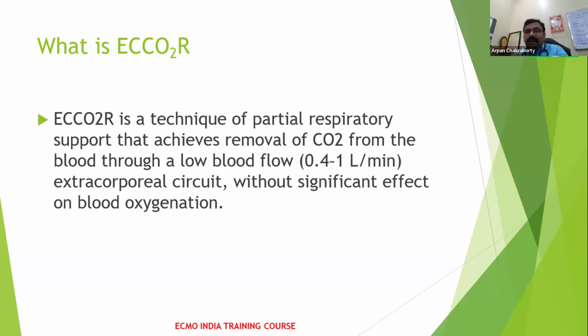Now, when ECCO2R came into the picture with ECMO, the idea was not to use this technique for carbon dioxide removal. It was a technique to be used for the preservation of the lung function or to prevent the barotrauma or the volutrauma.